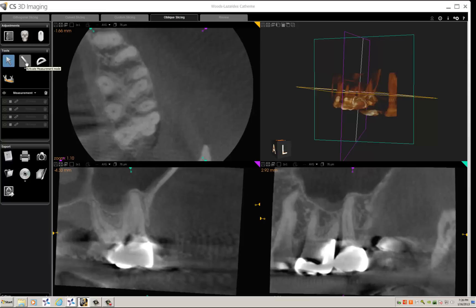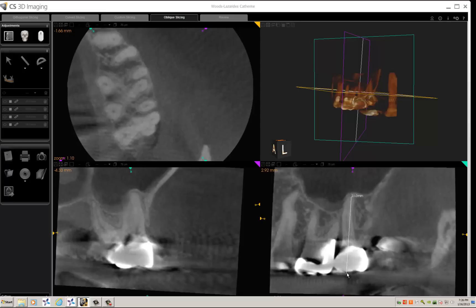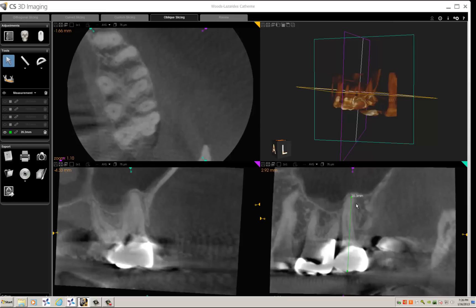I click on the ruler, put one pointer at the apex of the root, and come down to about the midpoint. It says 20.3 millimeters, and I'll enter that into the record.